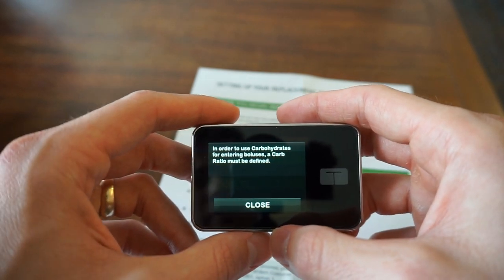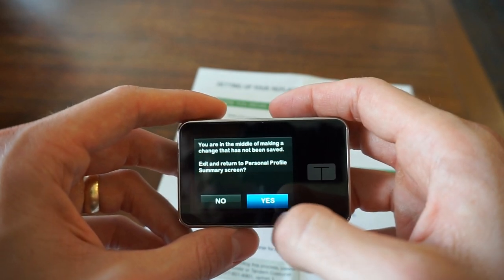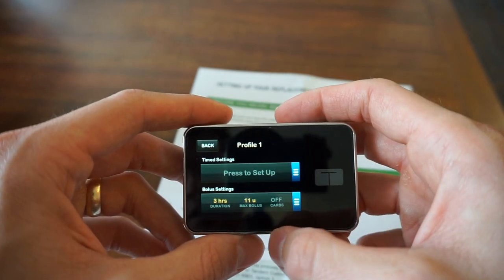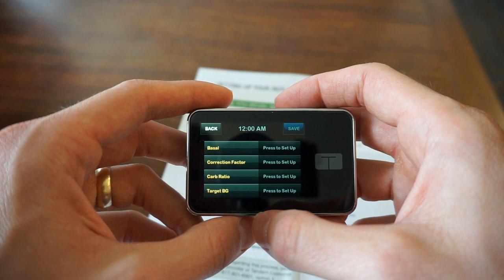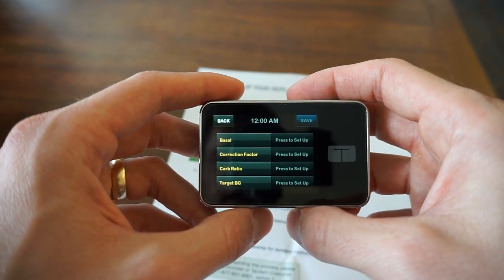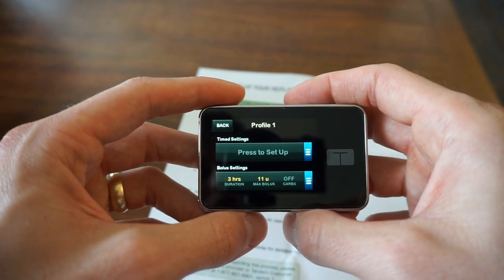For Carbohydrates: in order to use carbohydrates for entering boluses, a carb ratio must be defined. So I'm going to have to go back and save first before exiting. I'm going to have to set up the carb ratio specifically in order to have carbohydrates turned on.